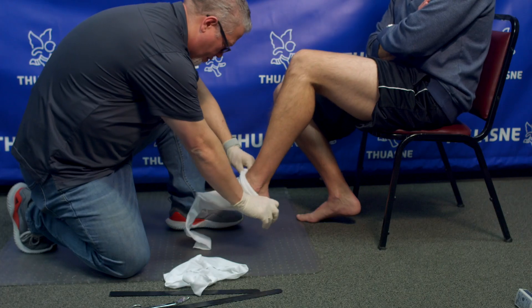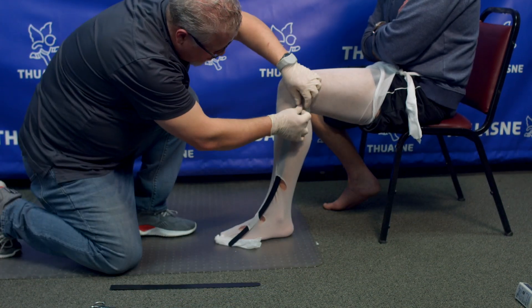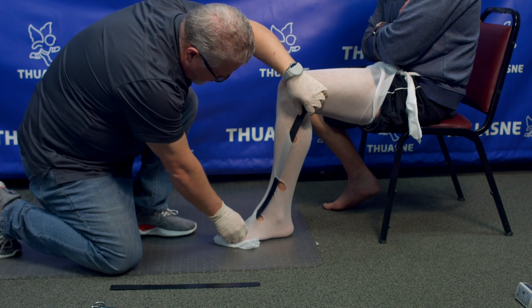Start by placing the stockinette and the cut strip. We recommend the cut strip to be positioned anterior on the dorsum of the foot to transition laterally.